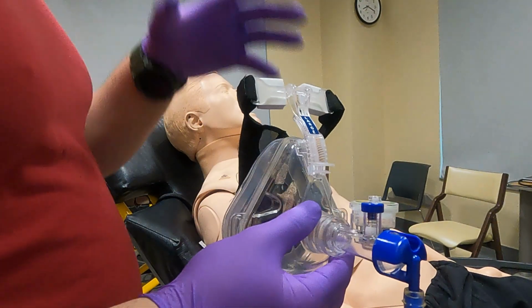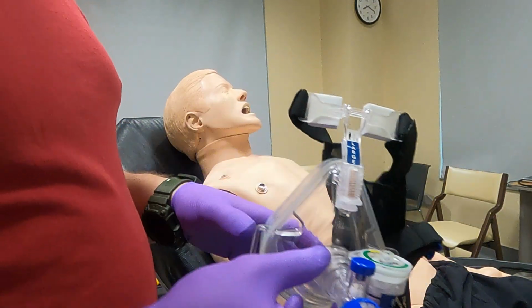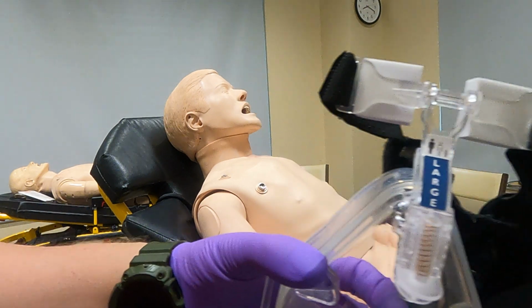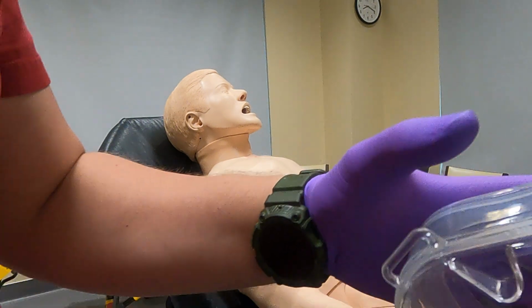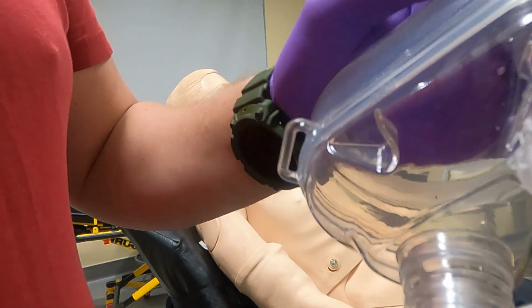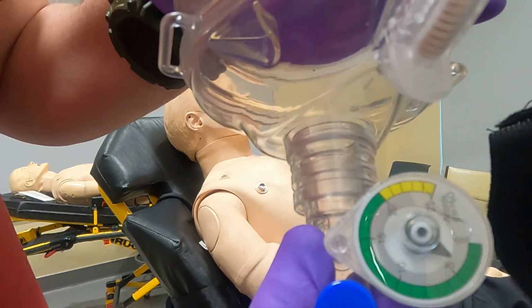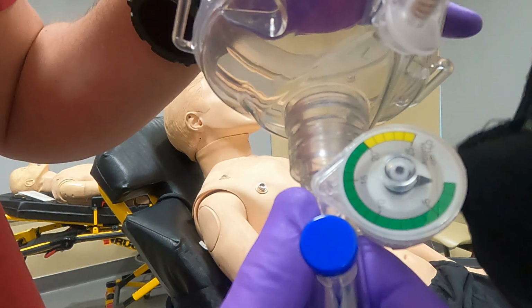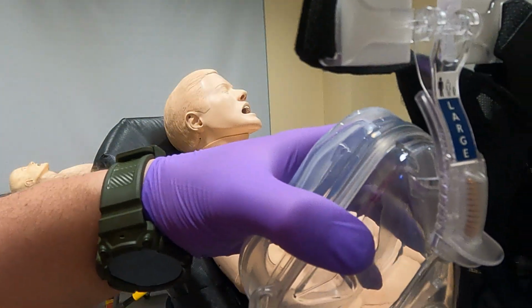Now, I would turn my flow setting up to whatever I wanted, so I would turn it up to 8 or 9. So I'm just going to turn it on real quick so you guys can see. As your patient breathes, you'll see that dial will move. It should go about to 5, which is the PEEP that we want to deliver.